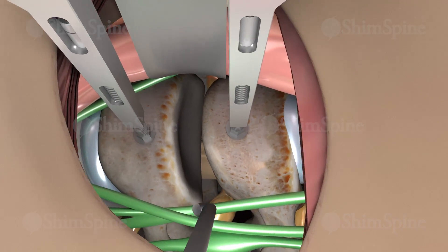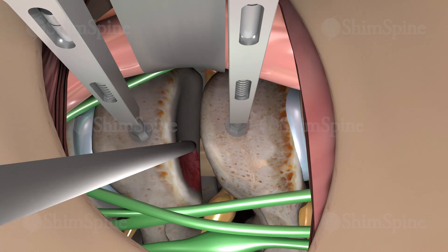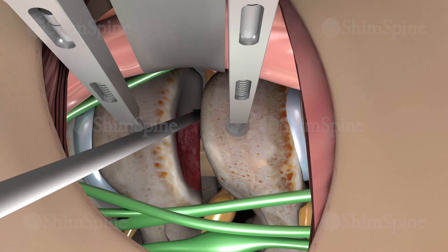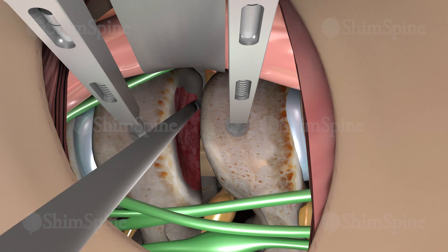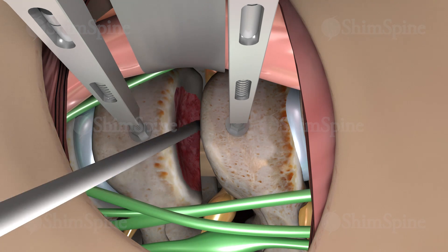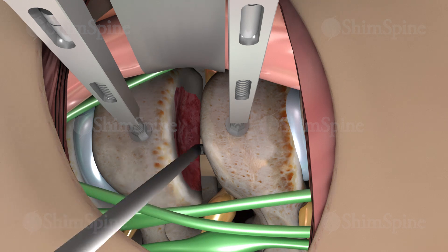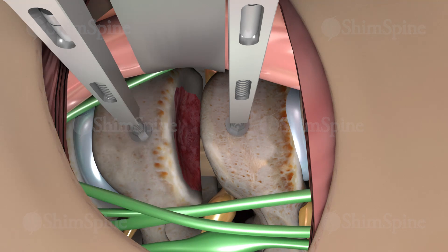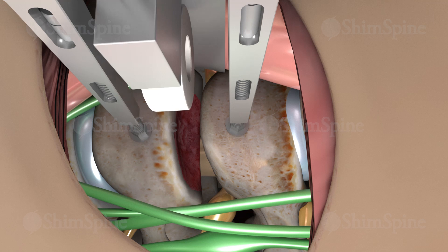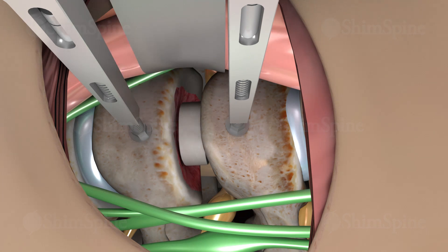Compressing bone spurs can also be removed. The bone edges are scraped clear of all soft tissue and contoured appropriately to accept the bone graft or cage. Once measured, the appropriate sized graft is placed in the disc space.